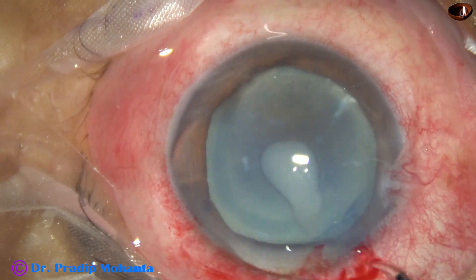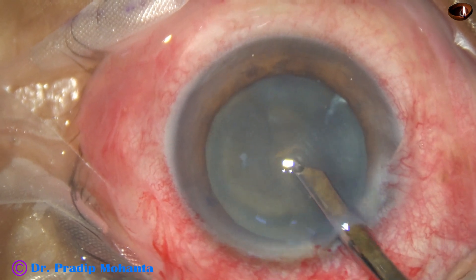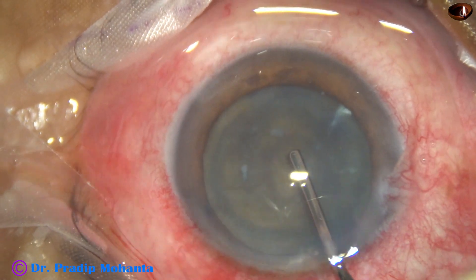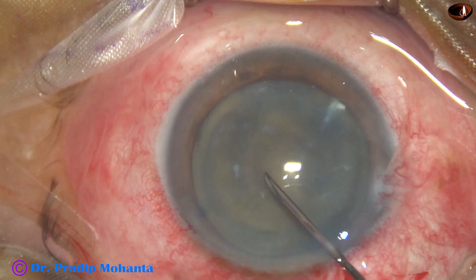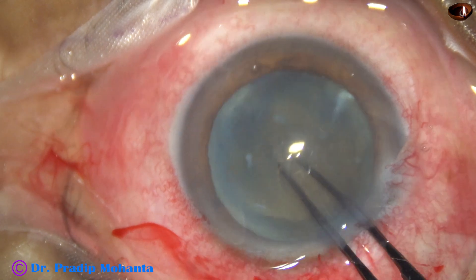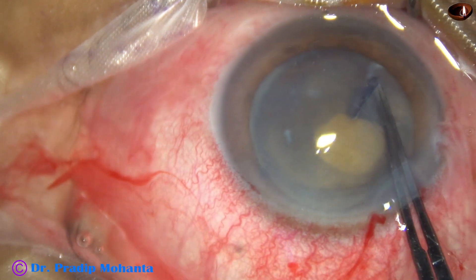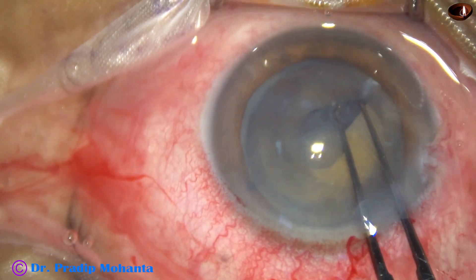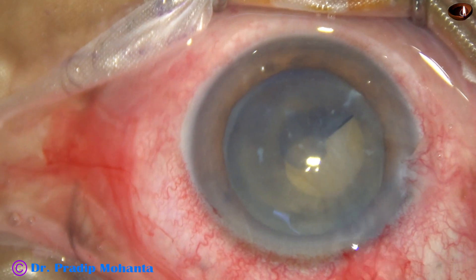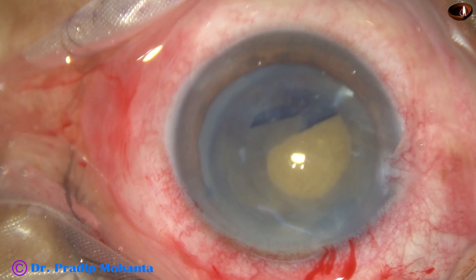We must take a sharp needle and pierce the center of the anterior capsule. Otherwise, if the zonule is weak, it will be more stressed if we try to pierce the capsule with forceps. Milky fluid has been aspirated and viscoelastic has been injected. Now we make the capsular tag holdable and go anti-clockwise — and see what happens at seven o'clock. There is a fibrous band. I try to pull this and there is too much stress on the zonule; it appears I will end up tearing the zonular fibers if I just try hard.